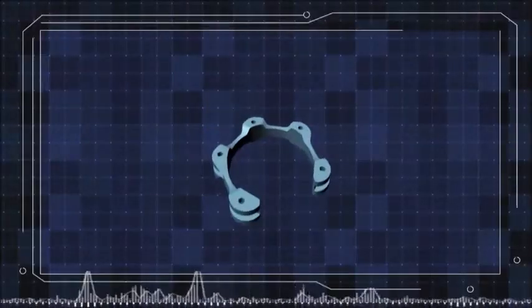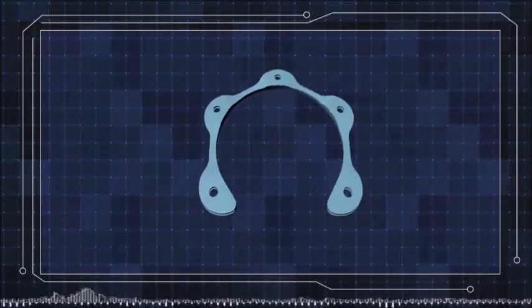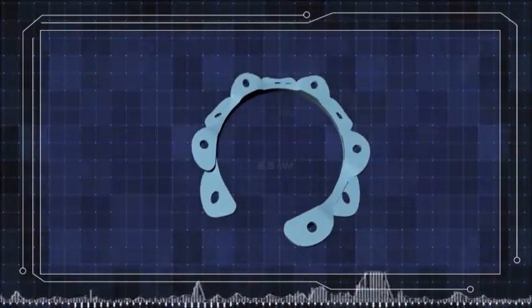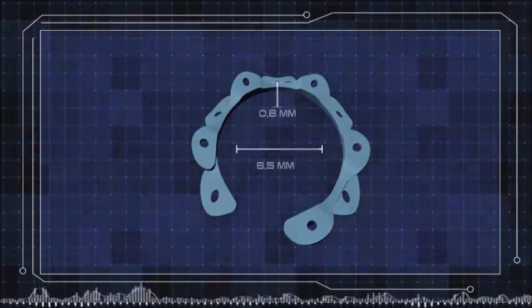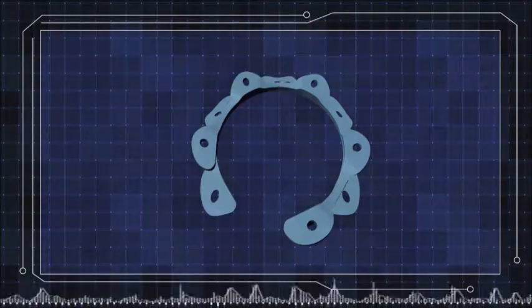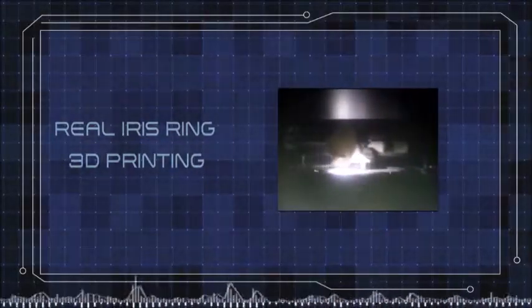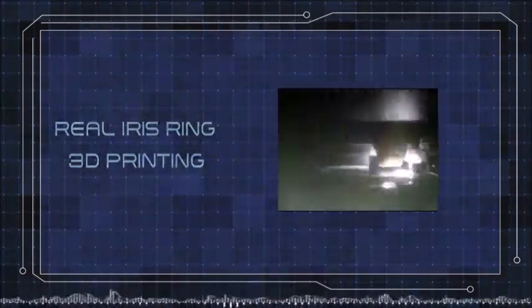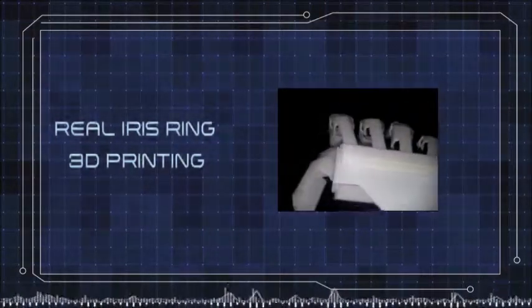Dr. Kanabrava, how about rotating the parts of the ring to interlock like a gear? With this idea, I can produce a ring that has a height of 0.6 mm while maintaining a diameter of 6.5 mm. Let's start the test, please. At this moment I'm printing the ring, and after I will start the tests in the pig's eye.